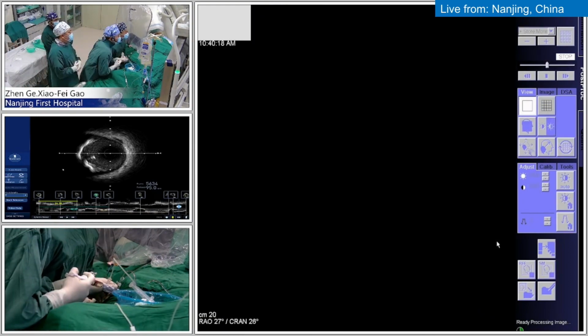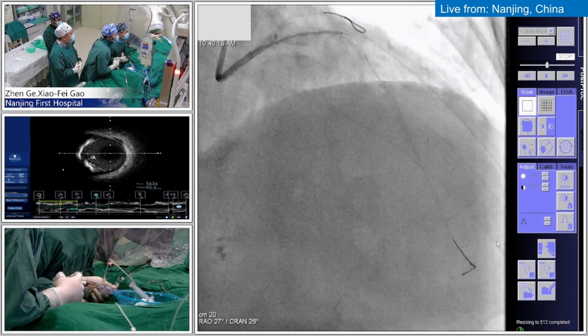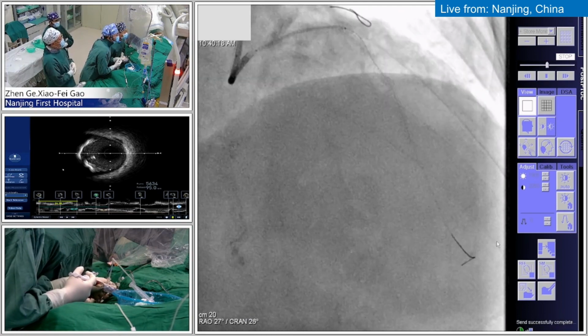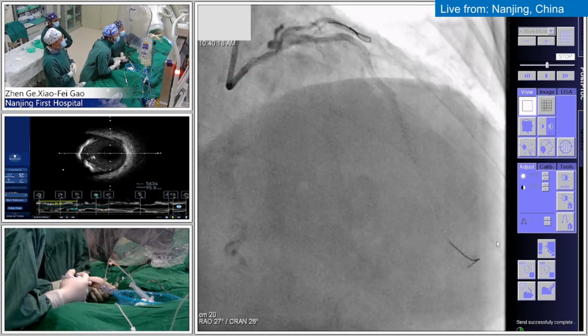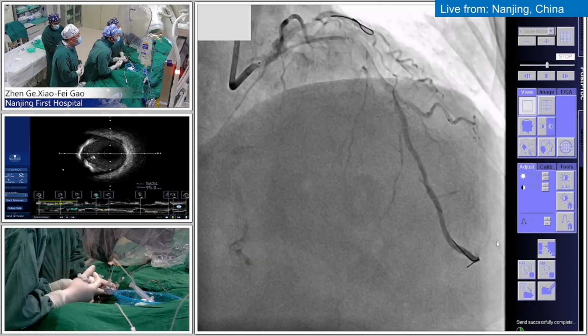That's a long left main stent. I like the position of it. And again, let's see how the vessel responds to it. Once again, a very good clinical decision. I think that just a high pressure balloon was used.